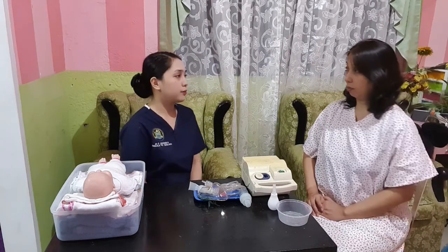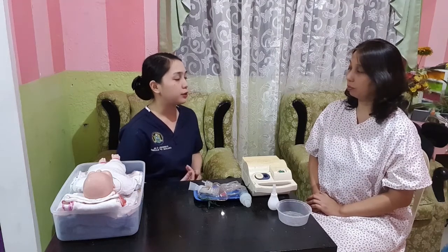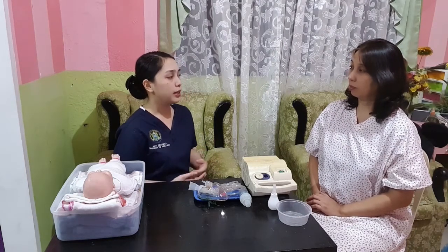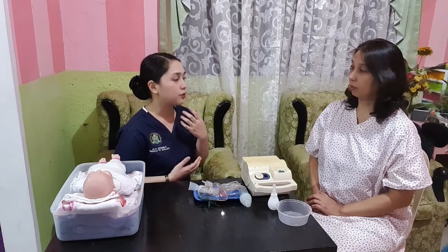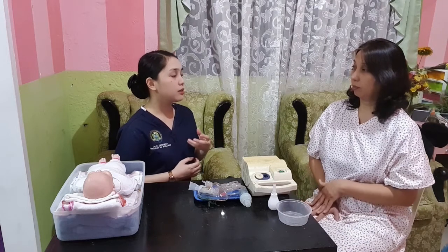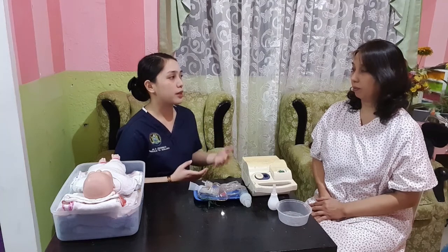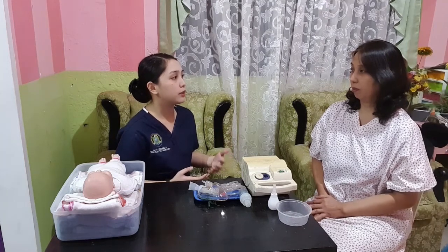So ma'am, I will be teaching you breathing techniques to properly inhale the medication. So first is I will be performing and then you will follow. So first is to slowly inhale through your mouth via the mouthpiece, which we will be using later. And then have a short pause and then slowly and completely exhale. And then we will have some resting breaths before doing the deep inhalation.